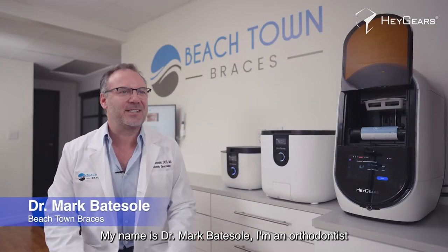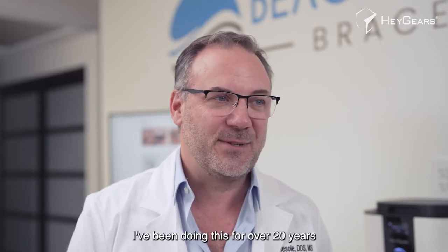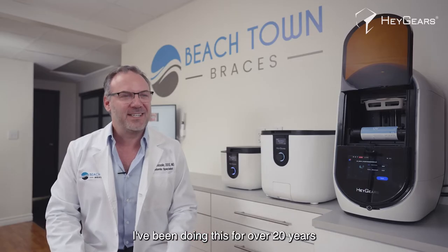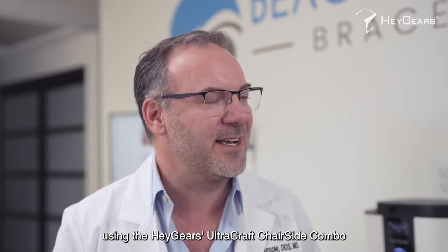My name is Dr. Mark Batesole. I'm an orthodontist here in Ventura, California, owner of Beachtown Braces. I've been doing this for over 20 years. Today we're going to talk about the aligner workflow using the HeyGears UltraCraft chair-side combo.